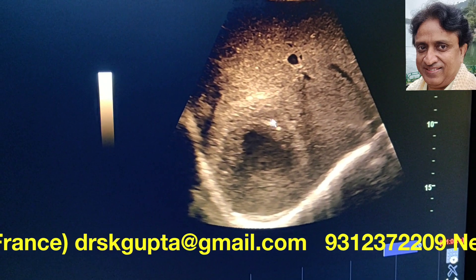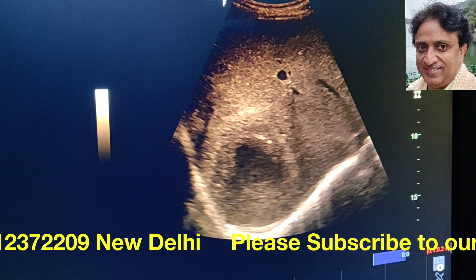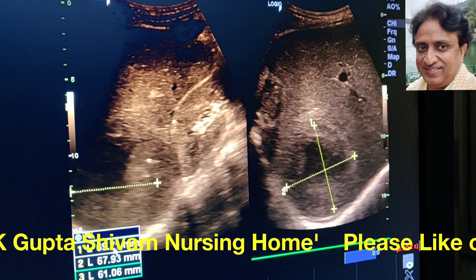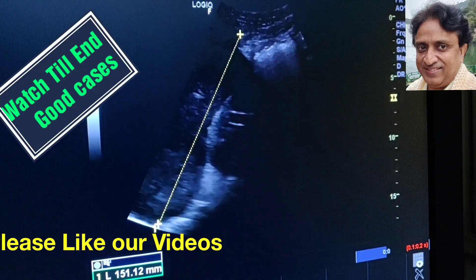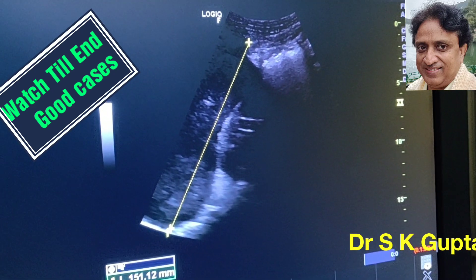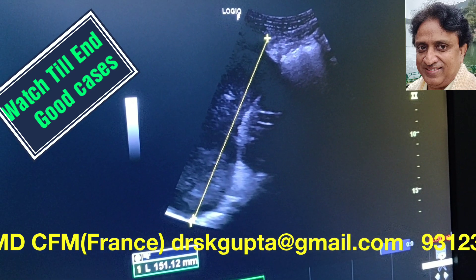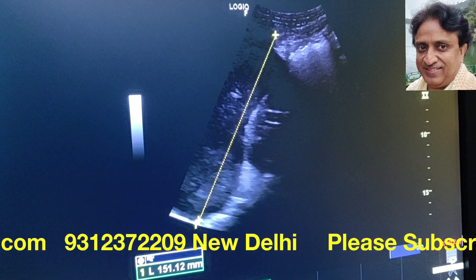This is the case of a small liver abscess. The margins are not very clear — it is merging with the surrounding liver tissue, but it is present in the posterior segment of the liver. We measured the abscess and found it to be around 7 cm by 6 cm. The liver is not much enlarged. The patient presented fairly early in the course of the disease. This is another spectrum of liver abscess, and again it is in the posterior superior segment.